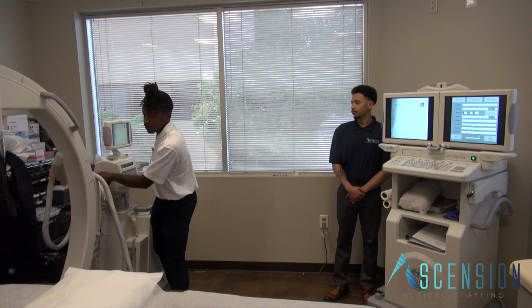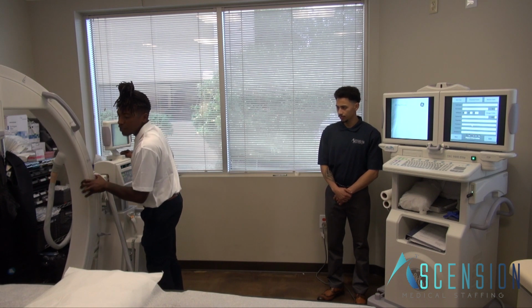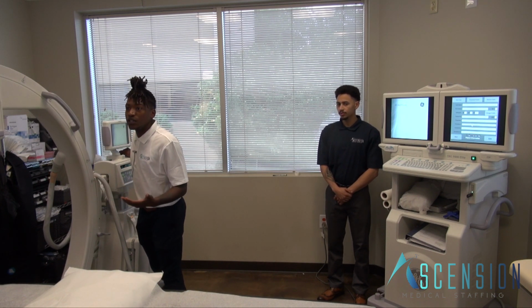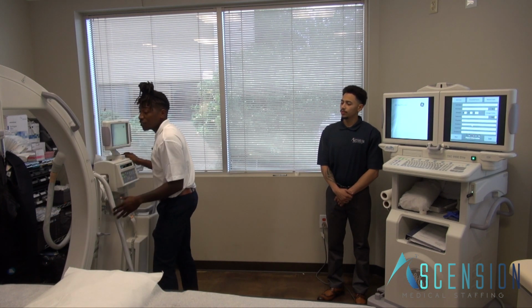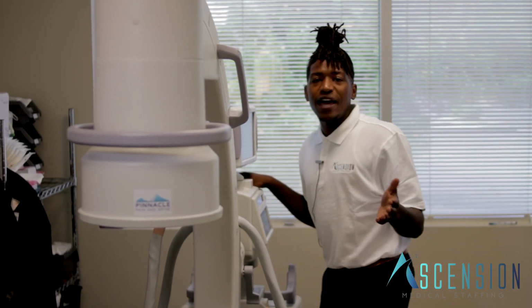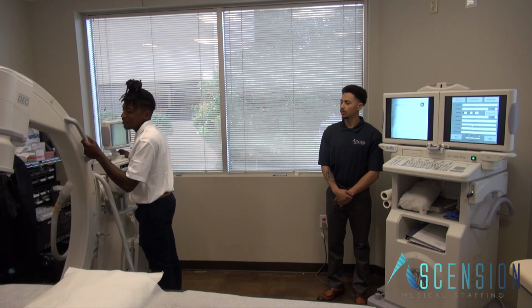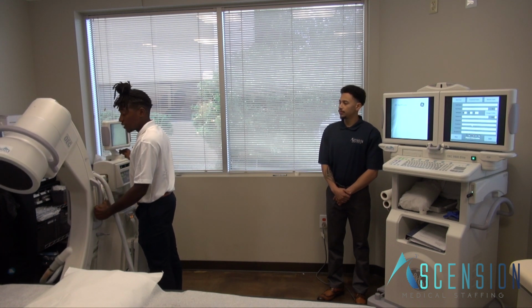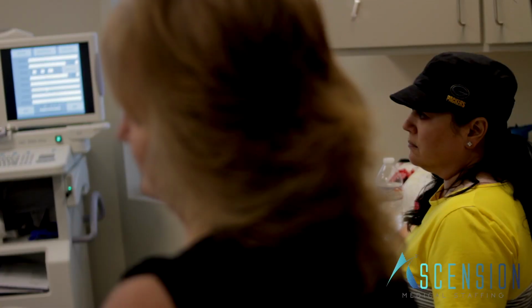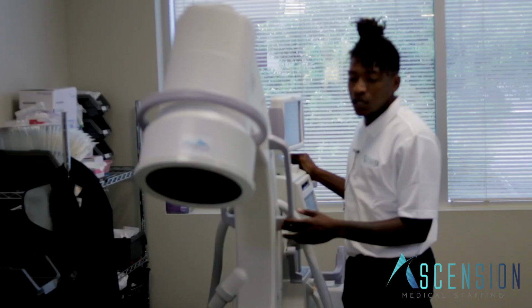And then from there, let's say the anatomy that we're focused on is on the left side of the patient. That would be closest to us with the patient face up. Your physician is going to ask for a steep oblique. You would want to go towards the side of the anatomy, not contralateral, towards the side of the anatomy that you're looking at. So we would give it a steep oblique. Some physicians like about 50 degrees, some 35. It just depends on who you're working with, of course. But we would give that oblique, and then the insertion of the needle comes.